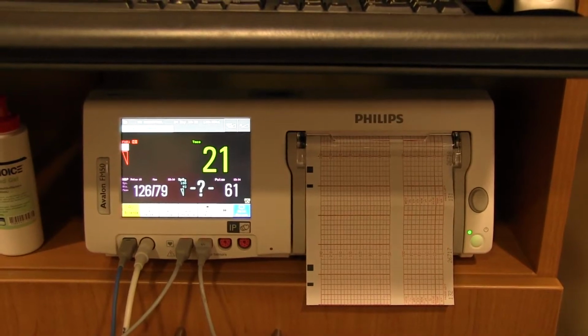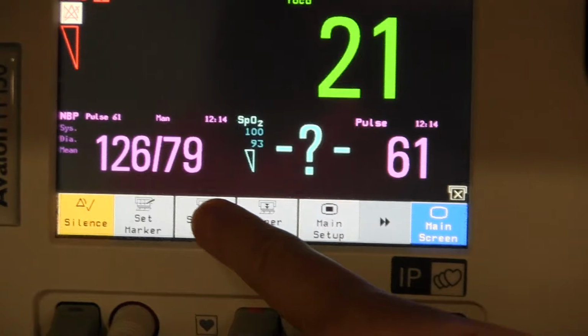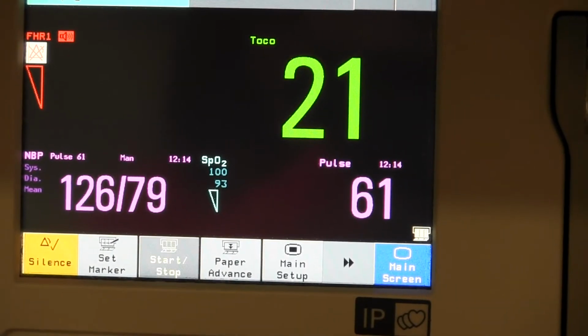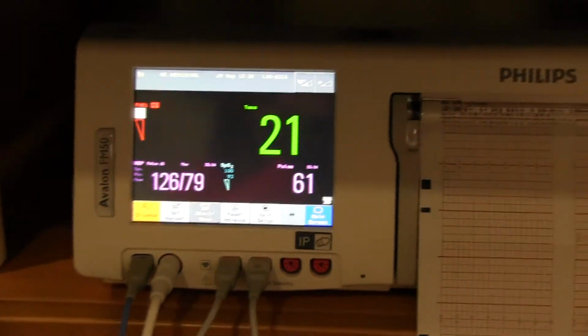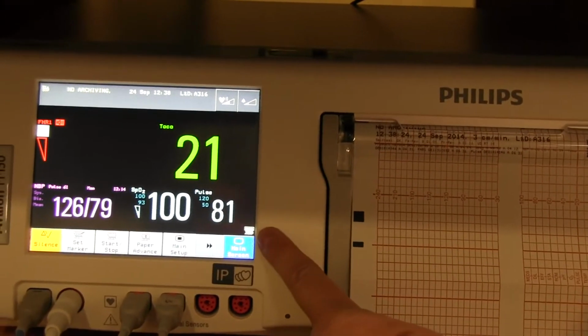If you want the paper to run, you will press the Start/Stop key. You will notice that it prints the date and the time on the monitor strip. Notice that the icon has changed and the X has disappeared.